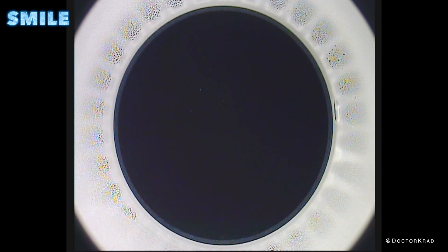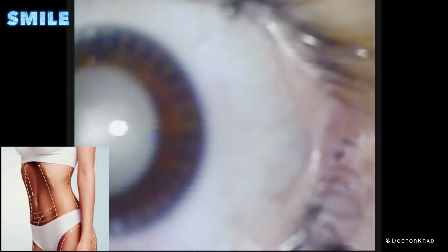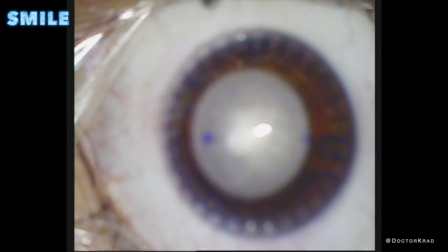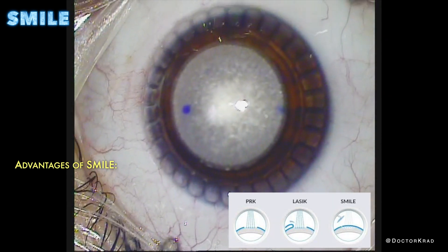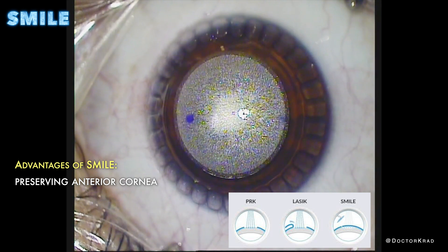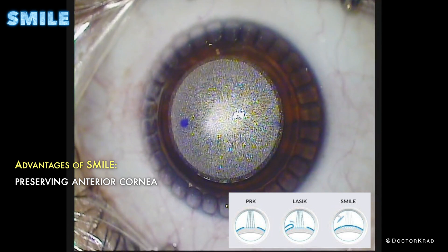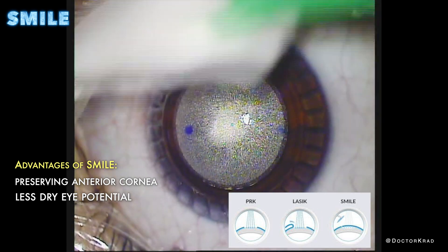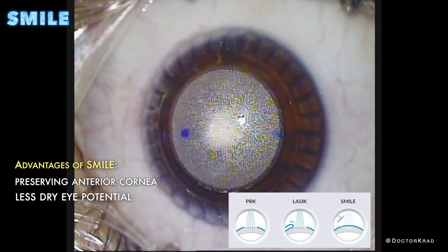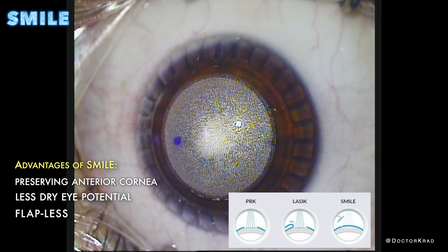SMILE is like laser liposuction of the cornea. We remove a precise amount of tissue from the center of your cornea, making the cornea skinnier. This new shape of the cornea focuses your vision. Unlike PRK or LASIK, we are preserving the anterior most part of the cornea, which is important for the biomechanical stability of the cornea. There is less dry eye potential since we are cutting through less corneal nerves. There is also no flap, and therefore no flap-related complications that can occur.